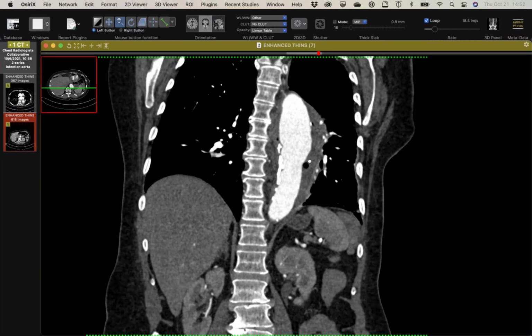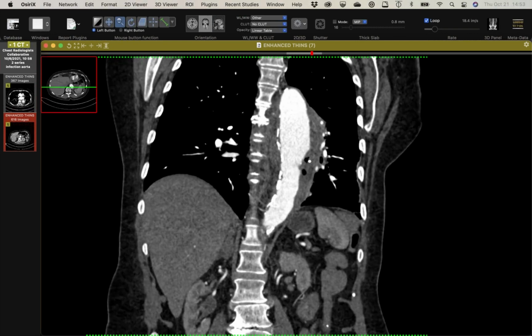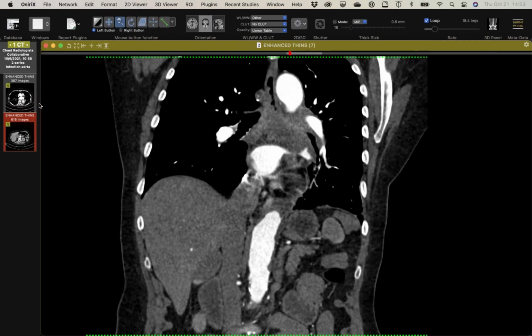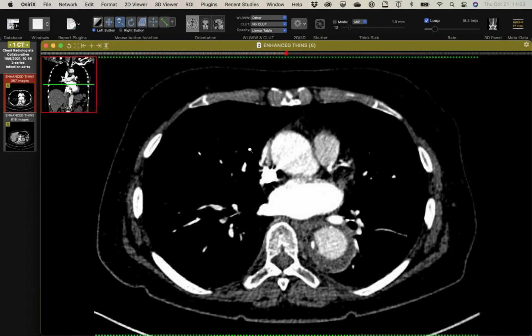Yeah, I'm going to try to show a case similar to this maybe next week or the week after, but it reminds me of a case that I've been waiting to get information about that had some similar features. But I can't remember whether in that case there was potentially a fistula from the esophagus, so I don't know. I can't quite remember at the moment. This one did not involve the esophagus. There's no fistula to esophagus or lung.